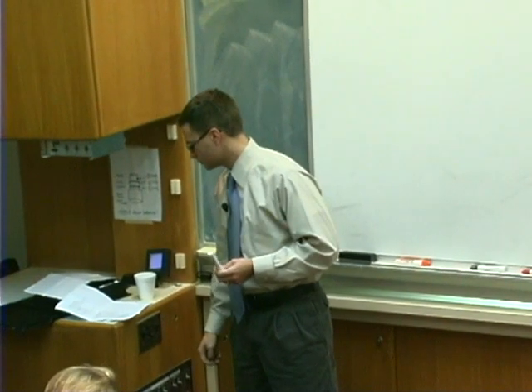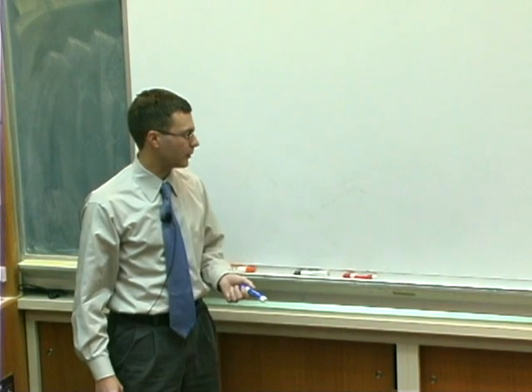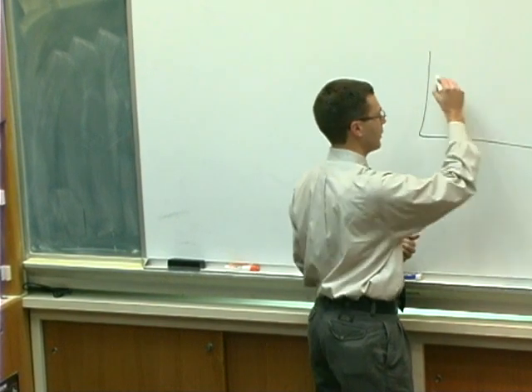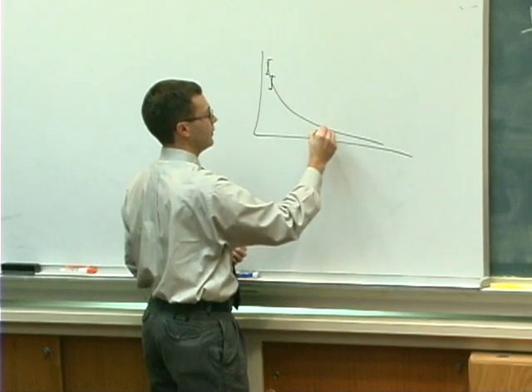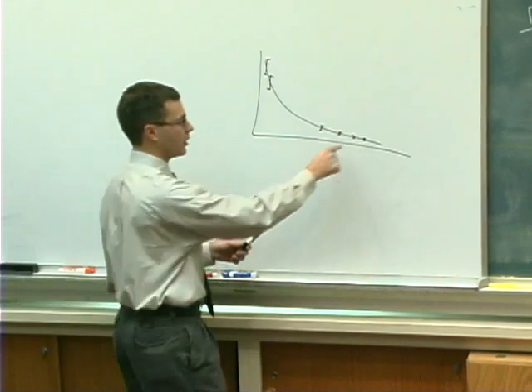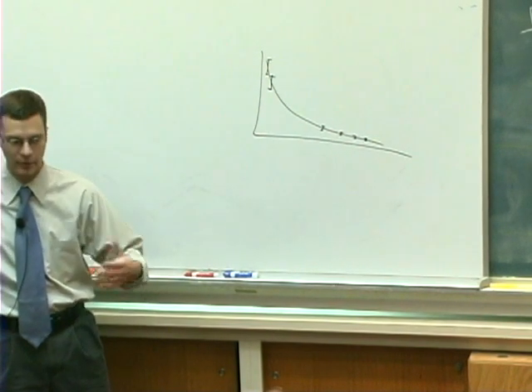All right, so let's talk for a moment then about filtering in the context of data analysis and all the rest. So we've established that fMRI noise has this property of having this 1 over f pattern, and that furthermore the variability of the noise is greater at low frequencies as compared to higher frequencies. As a consequence, in our analysis of the data we fit a curve to the average power spectrum from the brain, and then use that to try and anticipate how much noise is going to be in the data under the null hypothesis.